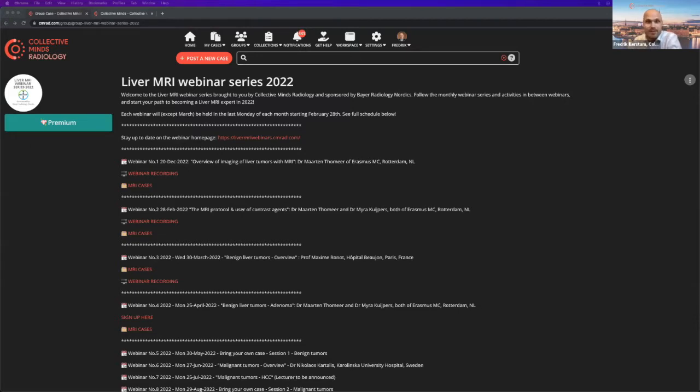This will be webinar number 4, as we have done sessions in the past, an overview in December by Dr. Maarten Thomeer. We did an overview of the MRI protocol and the use of contrast agents with Dr. Thomeer and Dr. Myra Kuijpers. Both of them will present today on the topic of adenoma. And for those of you who missed the past webinars, all of them will be available on Collective Minds.